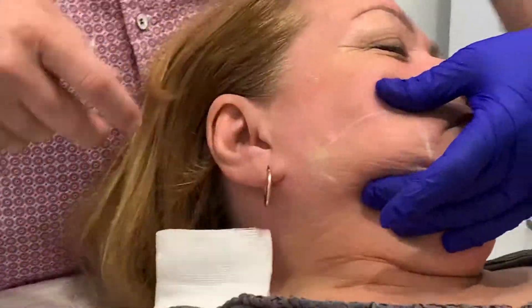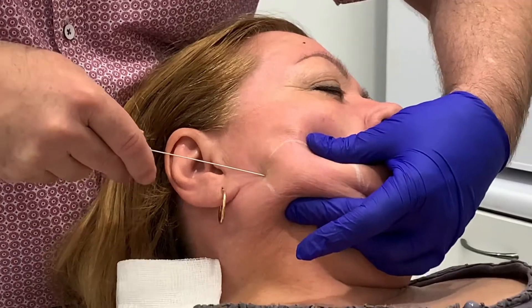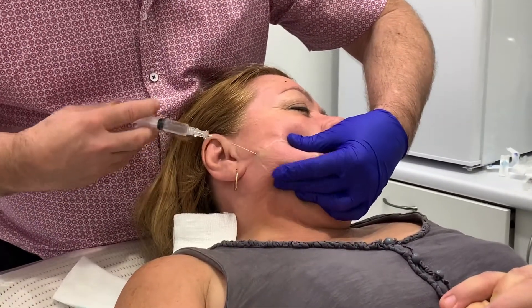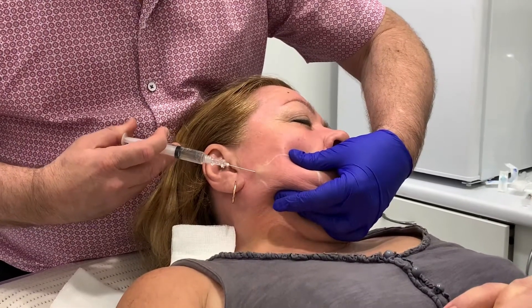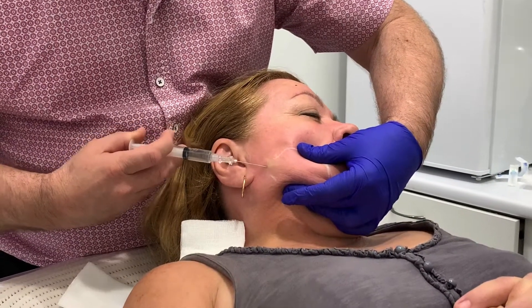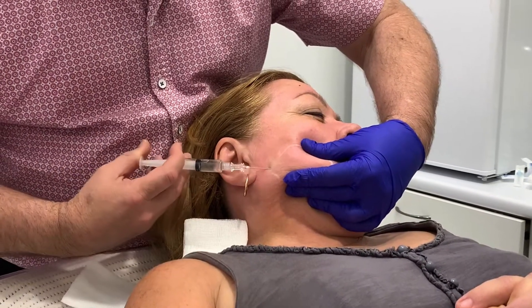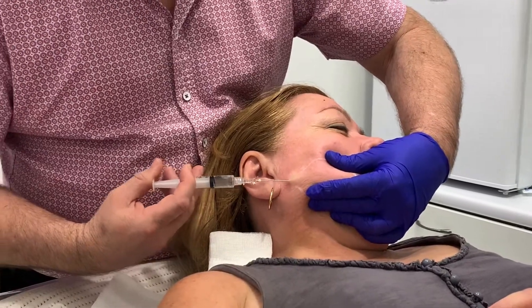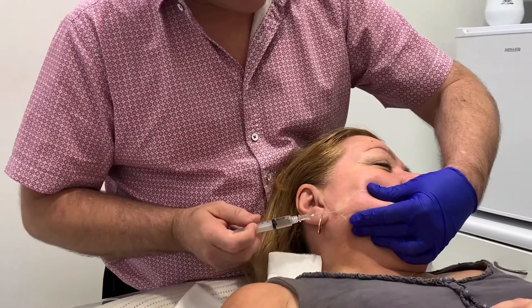Bend your neck for me, please. I just want to get into this tissue here. Is that painful? No, it doesn't hurt at all. Just gentle retrograde deposits. You've got to be careful that you don't damage your nerve here, so you need to know your anatomy.